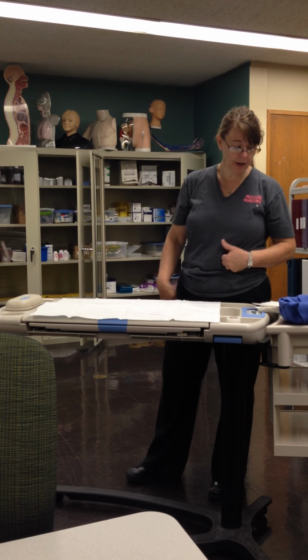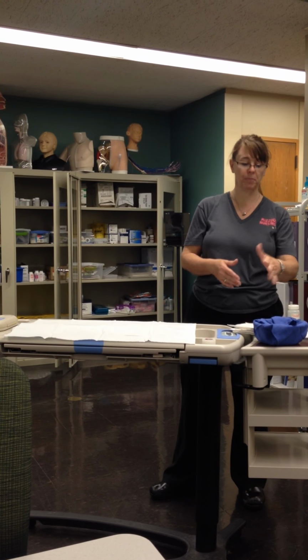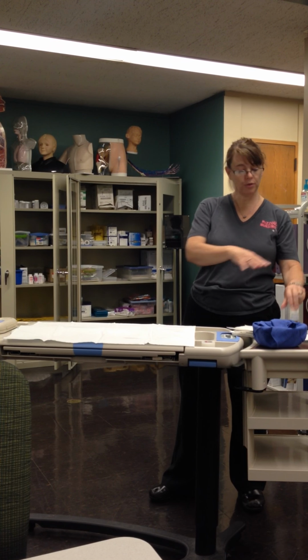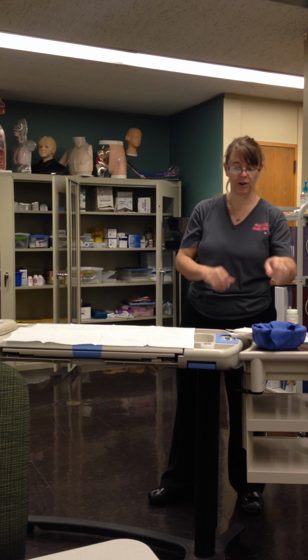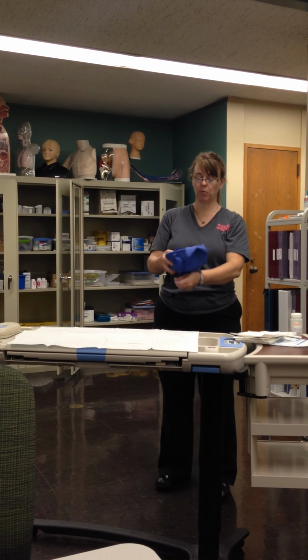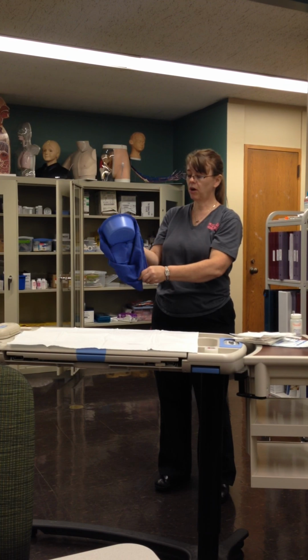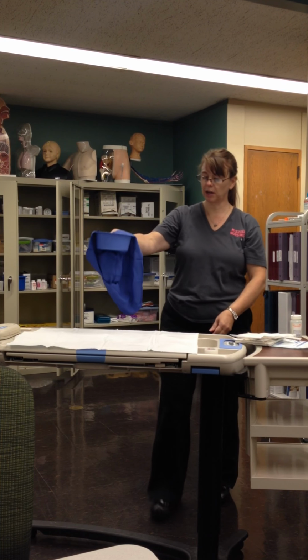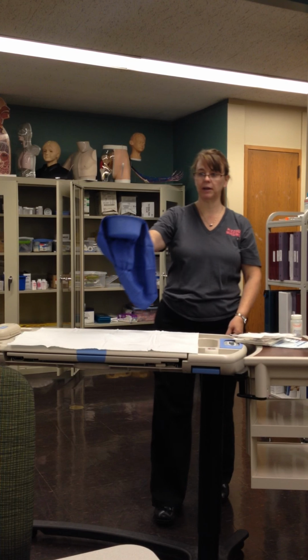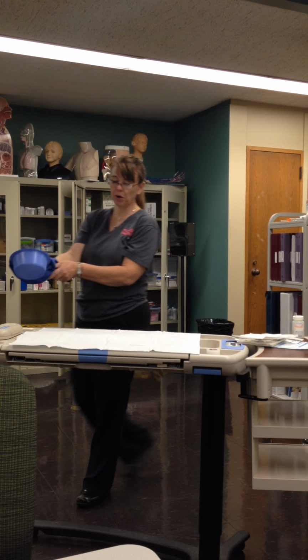Next, I'm going to put out, and as far as the order, it doesn't matter what order you put it out. You just have to put the bowl out before you do your liquid. Other than that, whatever you want to put out next is fine. I'm going to do my bowl. So I'm opening it away from me, and I'm also tucking it down under here, because if I don't, and this is dragging, and I put it out here, I've contaminated. So I'm just going to reach up here and hold it, and I'm going to go in from this side.